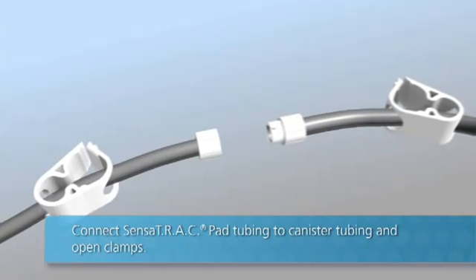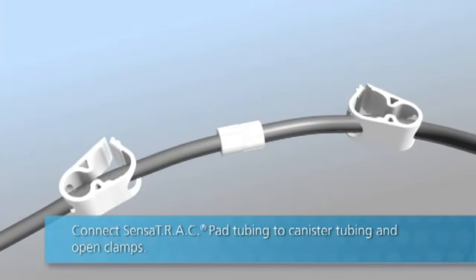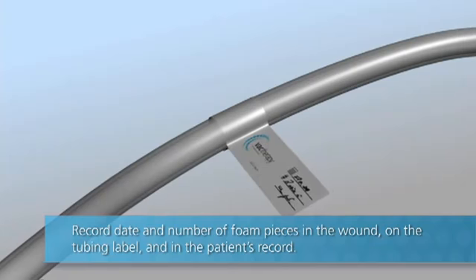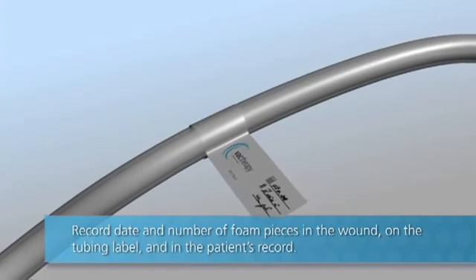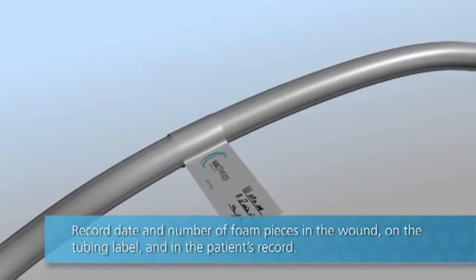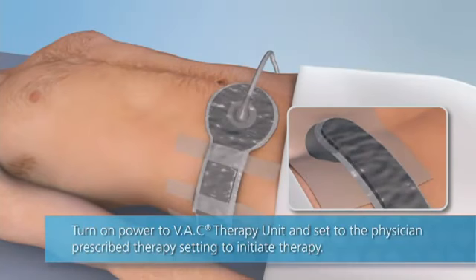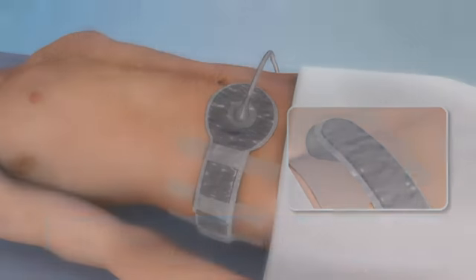Connect Sensitrack pad tubing to canister tubing and open clamps. Record date and number of foam pieces in the wound on the tubing label and in the patient's record. Turn on power to V.A.C therapy unit and set to the physician-prescribed therapy settings to initiate therapy.